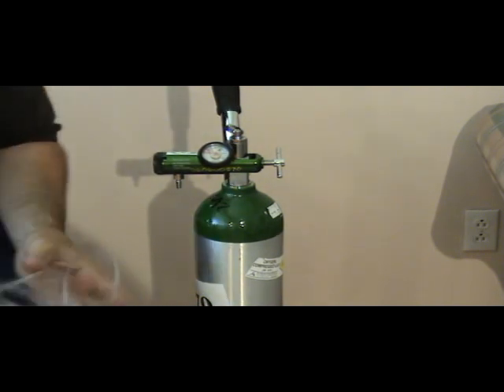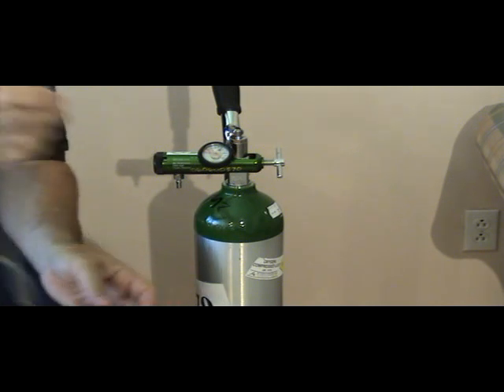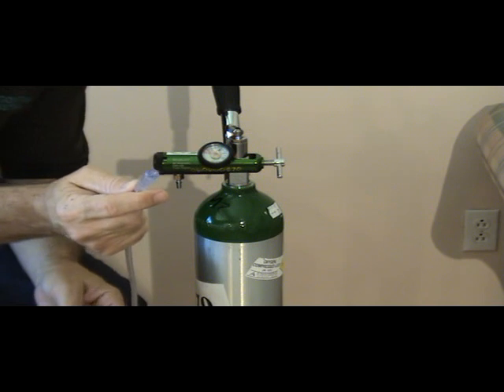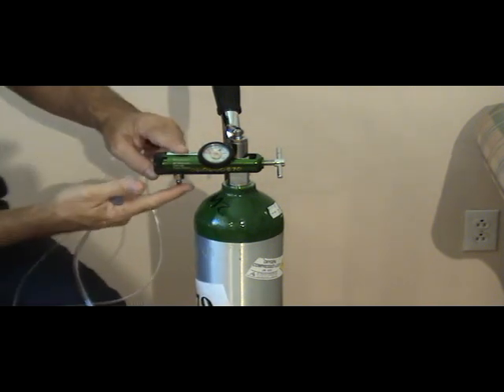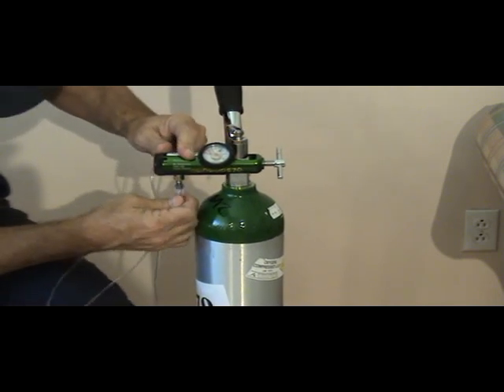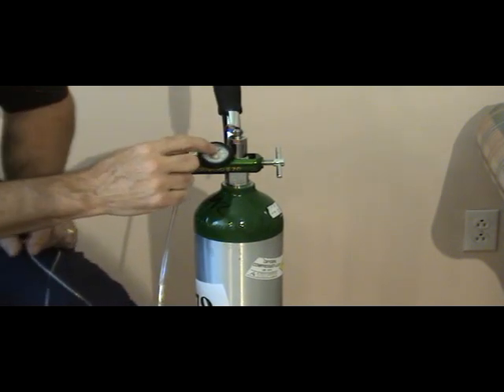Now if we needed to use this, the first thing we would do is take our nasal cannula, remember the end that hooks up to the concentrator, and we would place that down here on this nipple that's down below the regulator. You just fit that on. Okay, we're opened up here, you know that because it's registering 2,000.